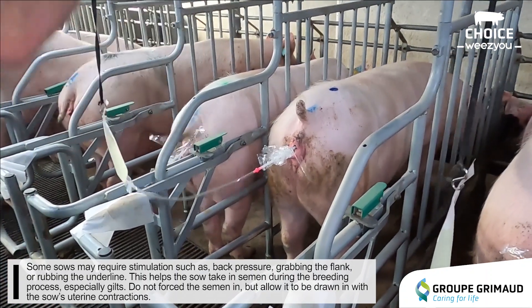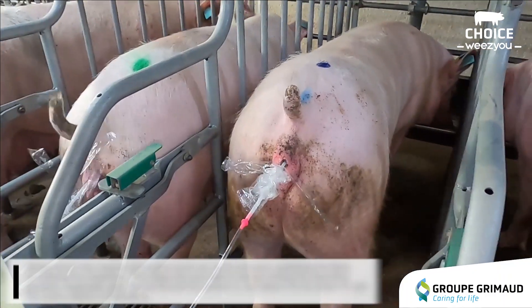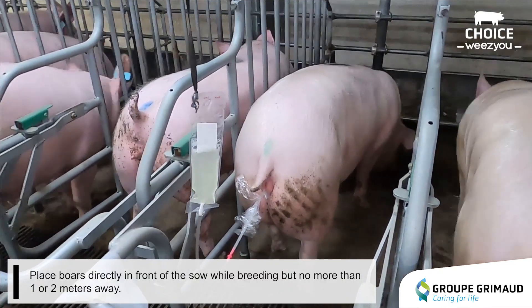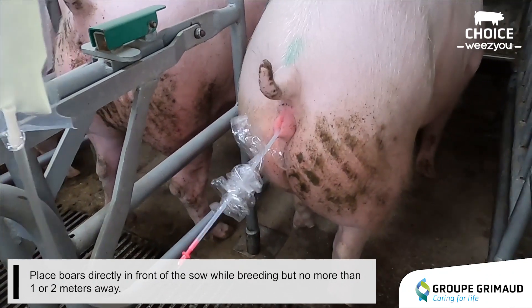Do not force the semen in, but allow it to be drawn in with the sow's uterine contractions. Place boars directly in front of the sows while breeding, but no more than one or two meters away.